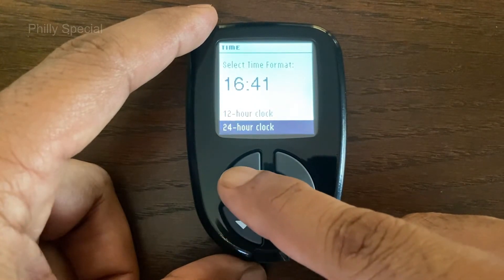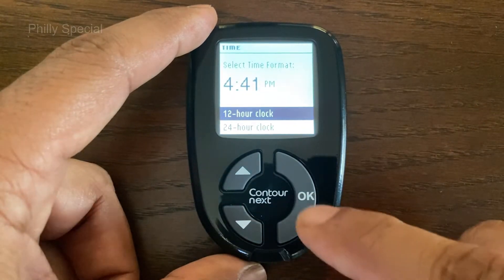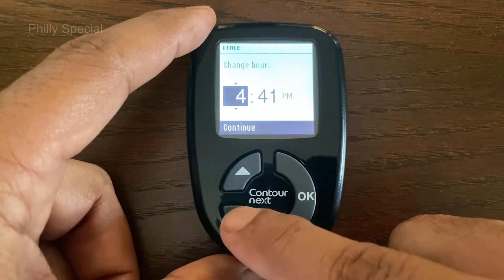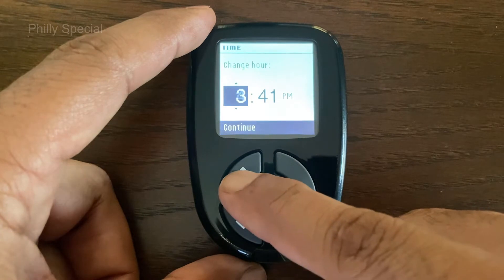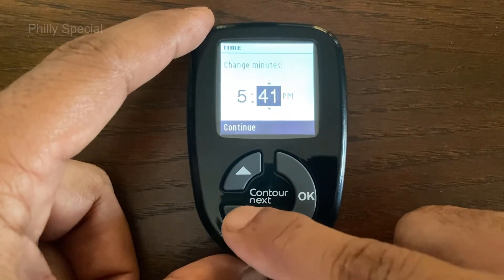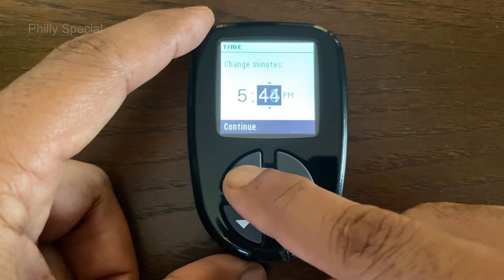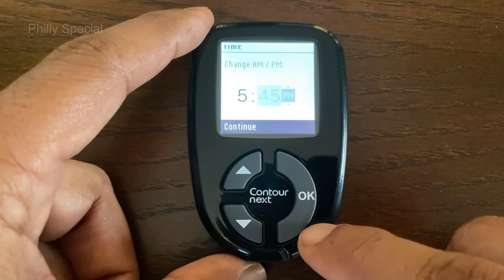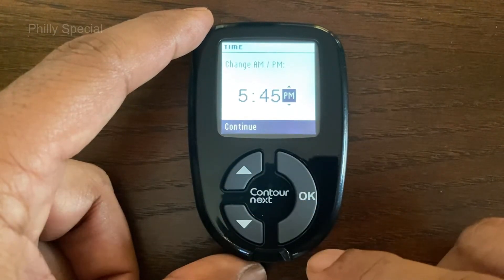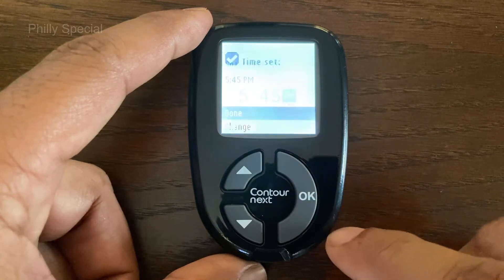Change the time format if needed to 12-hour or 24-hour format. With the hour highlighted, change the hour and press OK to confirm. In a similar way, change the minutes as needed. When in 12-hour mode, select AM or PM and press OK.